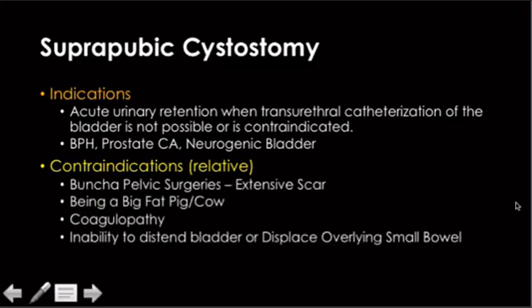Relative contraindications: they've had a bunch of pelvic surgeries before, they're a very obese patient and it's impossible to get at their bladder, coagulopathy, or inability to distend the bladder or displace overlying small bowel.